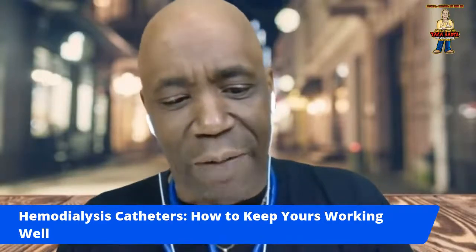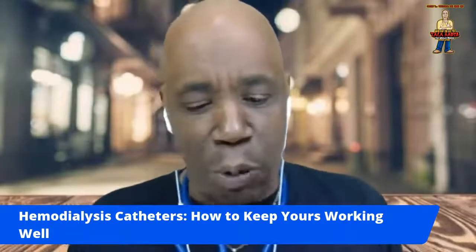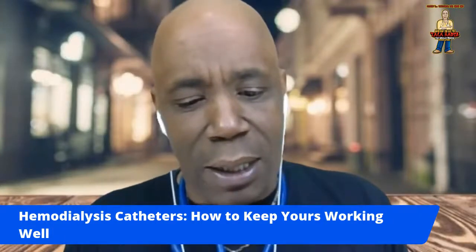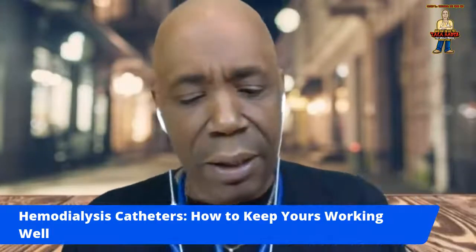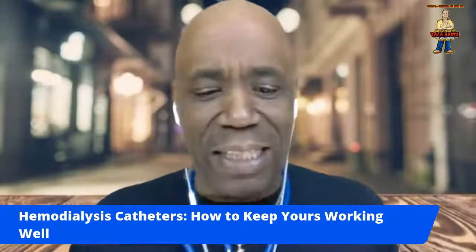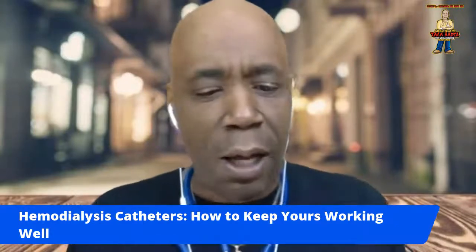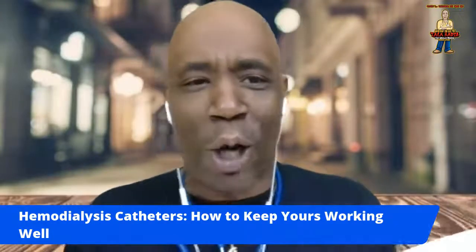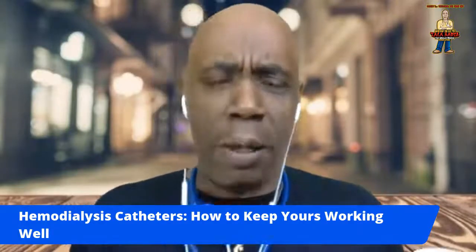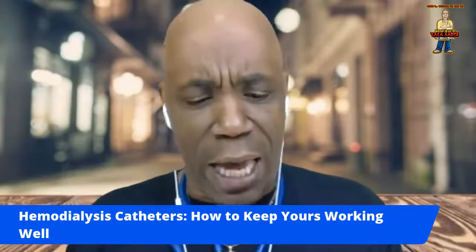Also, keep a record of your KT over V and URR numbers. Very important. And last but not least, ask them, what are the signs and symptoms of an infection? I done went over it. If you just joined in, you can go back and see, but this is very, very pertinent information to know about your catheter.